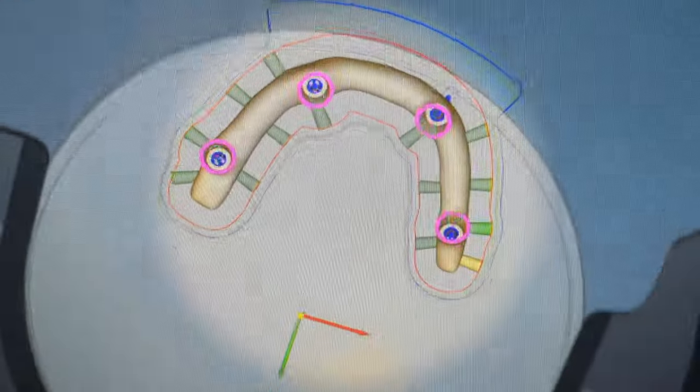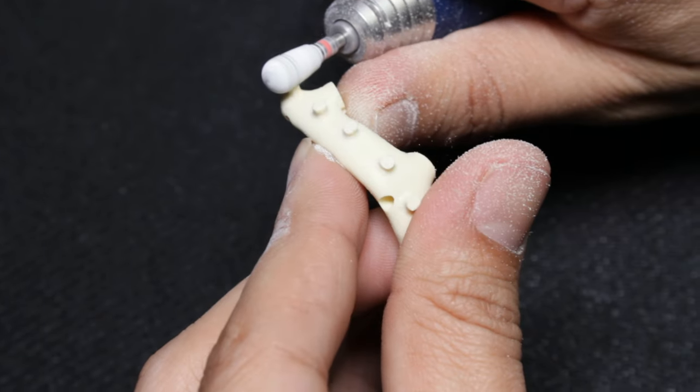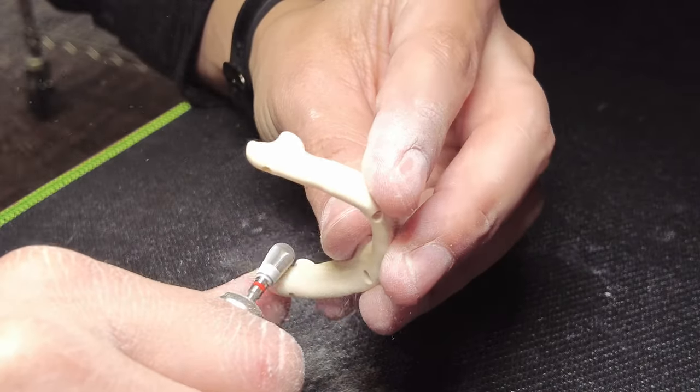Trilor is a high-performance techno polymer matrix with multi-directional glass fiber reinforcement. It can be milled in a PMMA milling strategy. Recommended are diamond or tungsten carbide burrs.